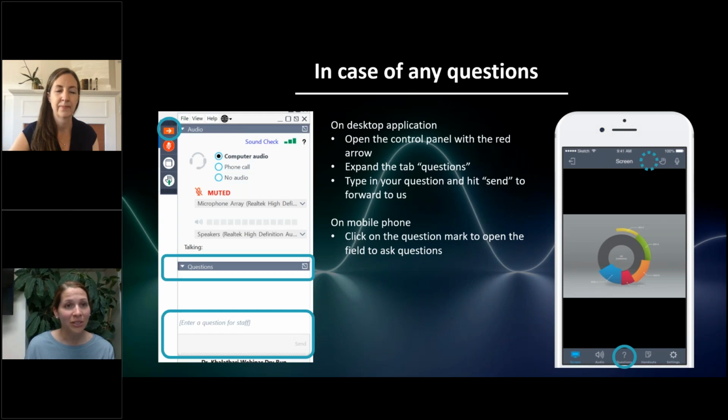Thank you. Next question is, density of cones declines clearly with increasing distance from the fovea. So doesn't photopic negative response mainly represent ganglion cell activity of the macula? Yeah, so that was one of the reasons that we did the study where we did the full field photopic negative against what we called the focal photopic negative, where we restricted the light stimulus using a plastic shield to the fovea. And we found that we did get a much more robust photopic negative response when we used full field. So that would argue that we are indeed getting peripheral retina contributions.